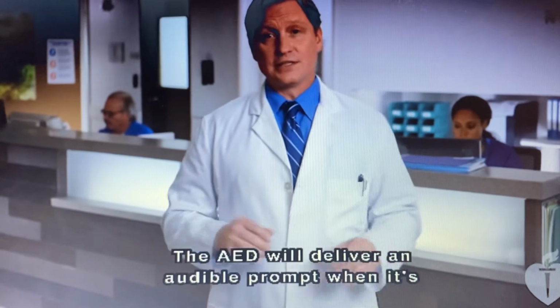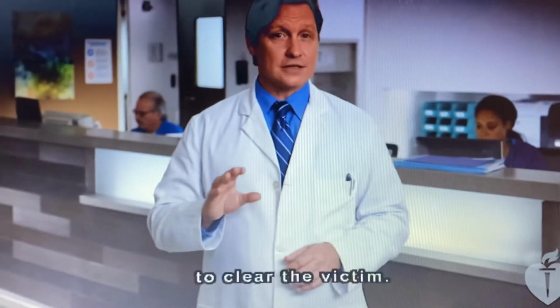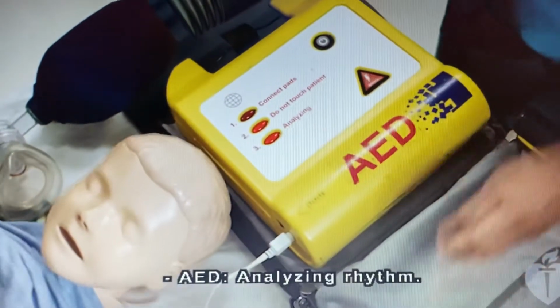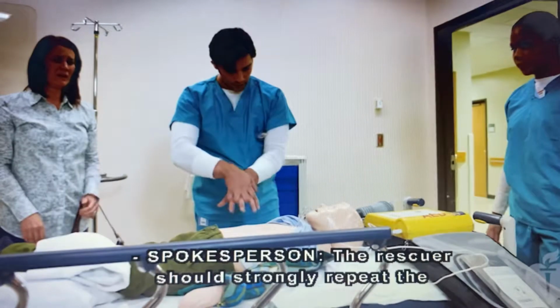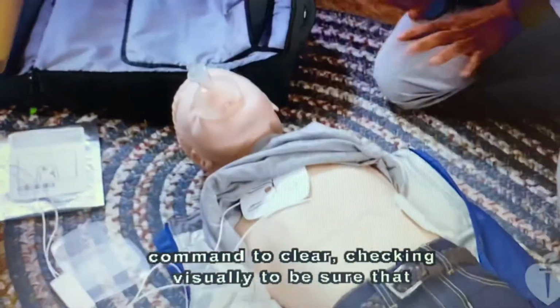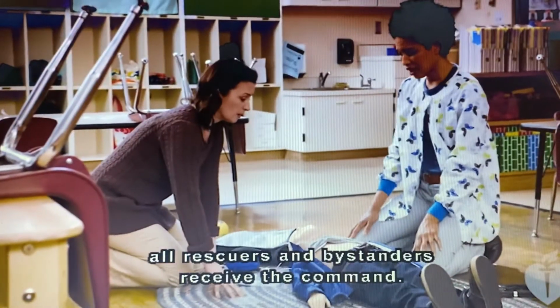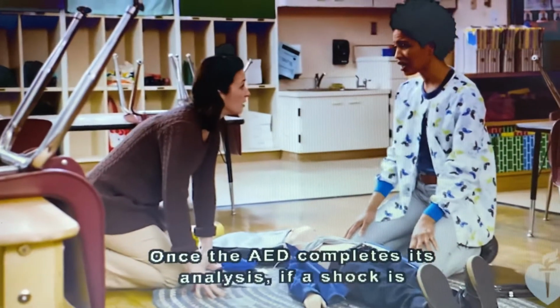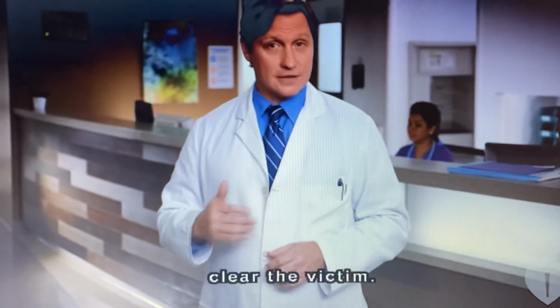The AED will deliver an audible prompt when it's ready to analyze the rhythm, followed by a prompt to clear the victim. Analyzing rhythm. Do not touch the victim. Clear. The rescuer should strongly repeat the command to clear, checking visually to be sure that all rescuers and bystanders receive the command. Once the AED completes its analysis, if a shock is advised, it will charge and then prompt again to clear the victim.